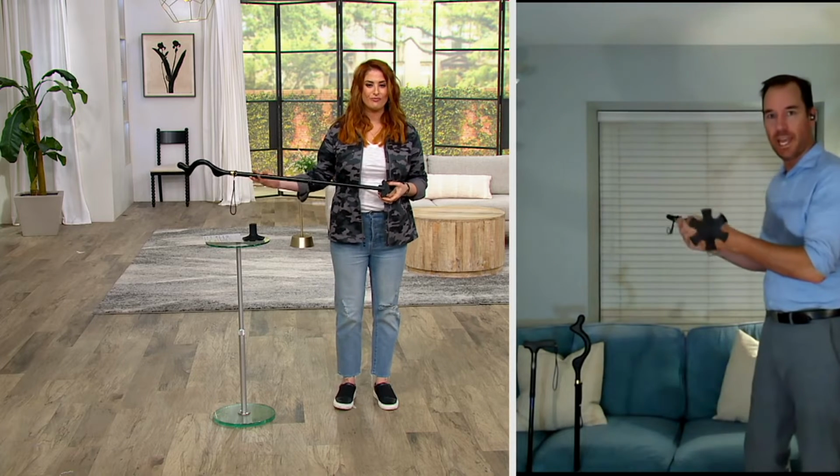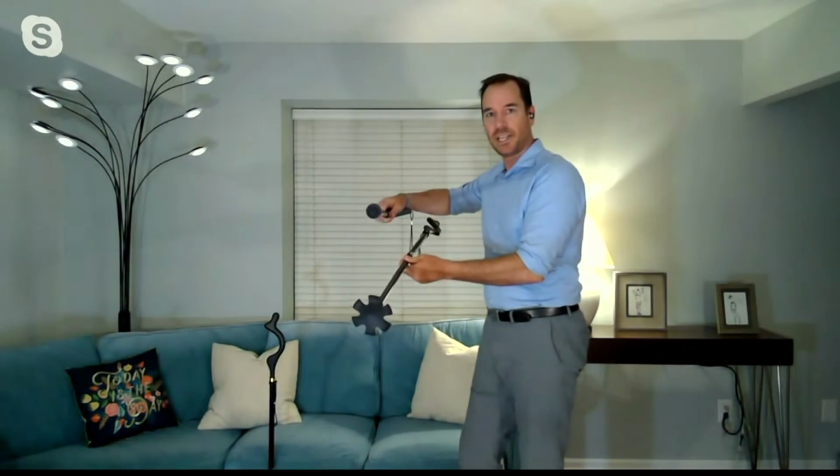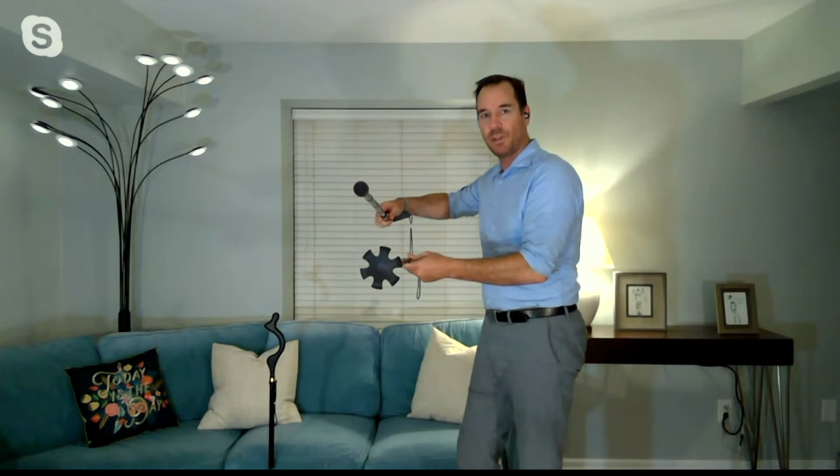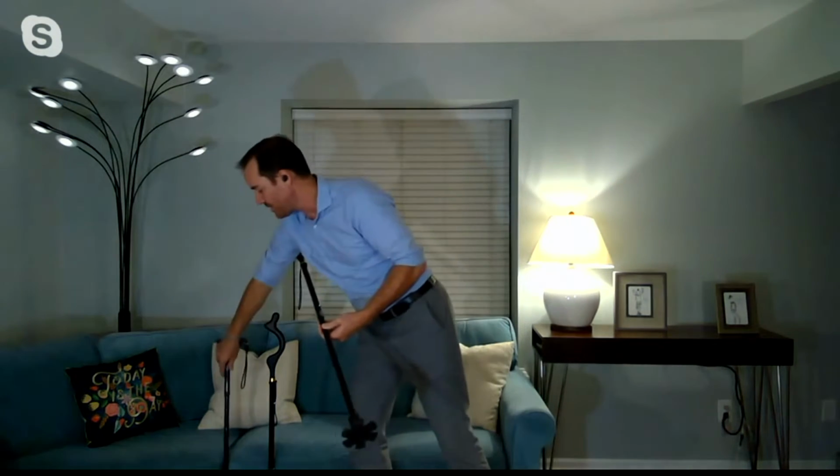A traditional cane is not going to have anywhere close to this stable or this wide of a base. Here's your traditional cane bottom, and here's the Campbell Cane. The Campbell Cane is much more stable, and this one, not so much. This is for someone who needs a little more stability through the day, but if you like to be more on the go and need less stability, I'd recommend that rocker tip, because it has that rounded top and is meant more for walking.